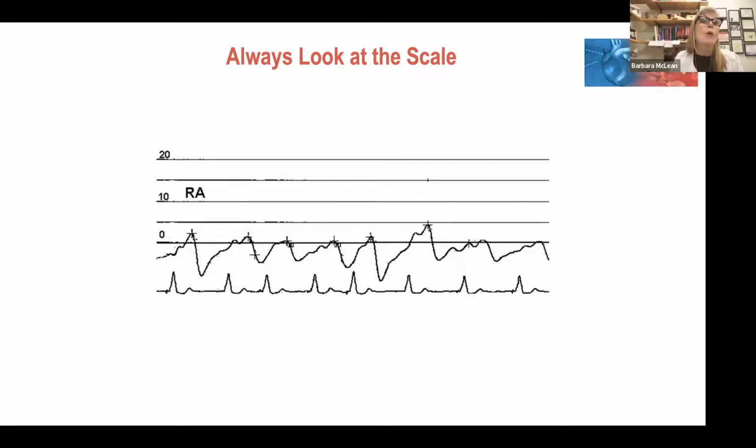And you have to be able to say, when I zero reference my transducer, I'm looking at atmosphere, which here in Atlanta is 748 millimeters of mercury. That means that any pressure my patient has, either above 748 or below 748, is what gets inscribed on the monitor. So quite honestly, if I had a CVP of 6, that means the actual pressure is 748 plus 6. No one wants to report a pressure of 754. So we just say, what's the pressure in relationship to 0? 0 is atmospheric pressure.